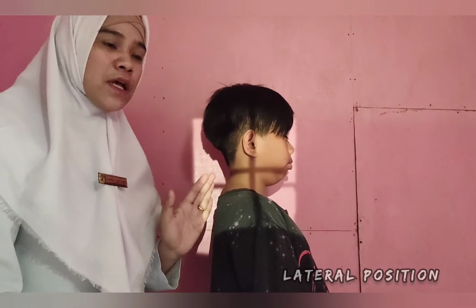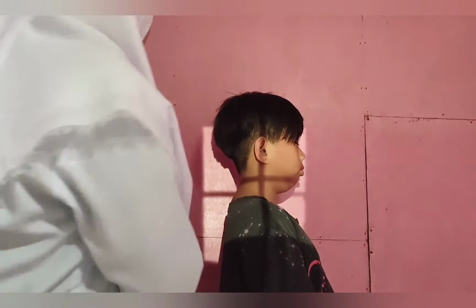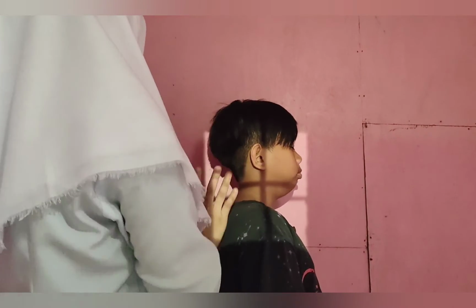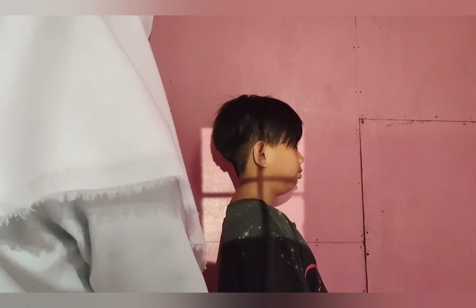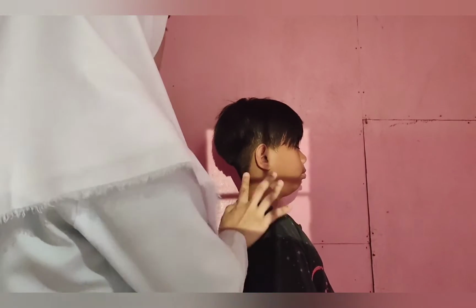Lateral position for cervical spine. Patient is erect lateral, then align mid-coronal plane to CR, then ask patient to relax and depress the shoulders. Then CR is perpendicular to IR, directed horizontal to C4.